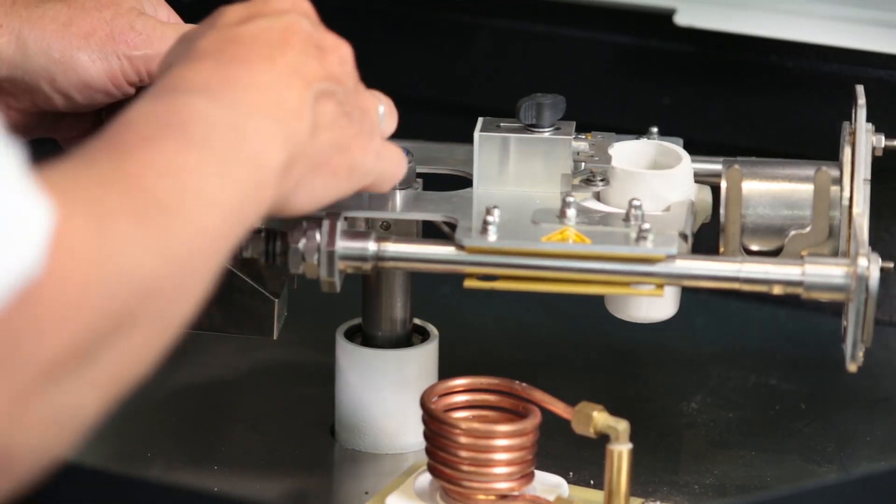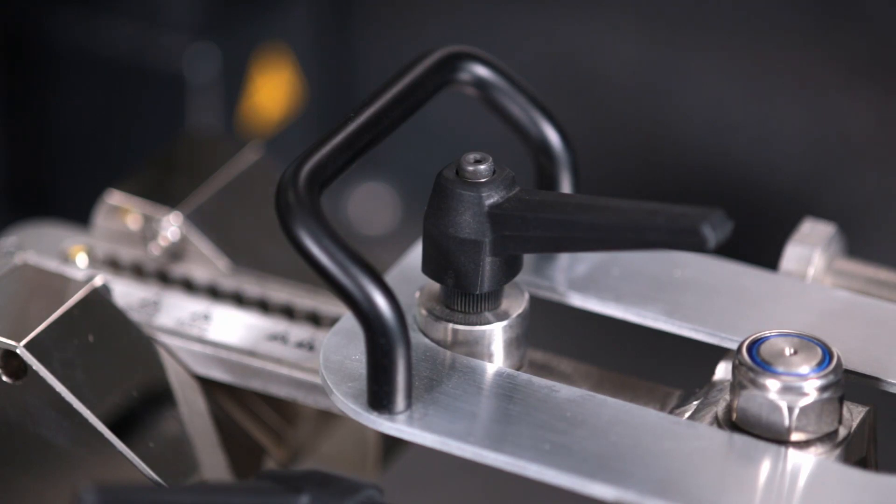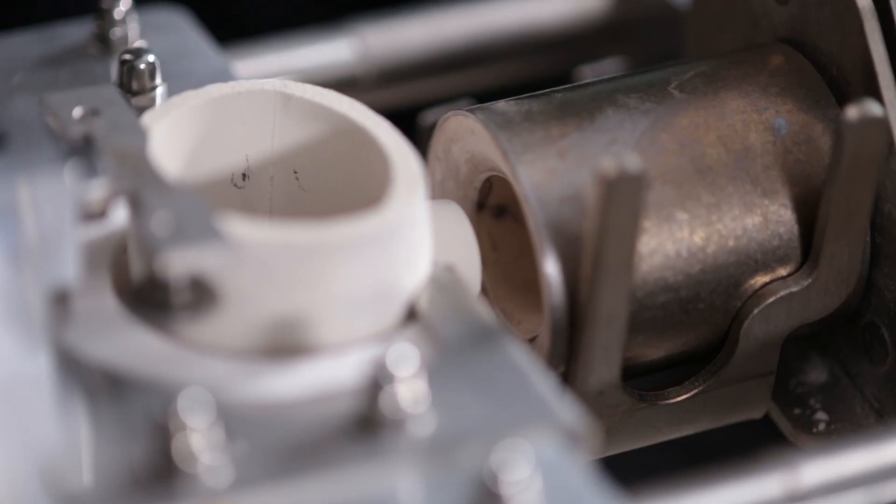The adjustment of the slider is done with the clamping lever. The crucible outflow opening should be located inside the casting funnel of the mold.